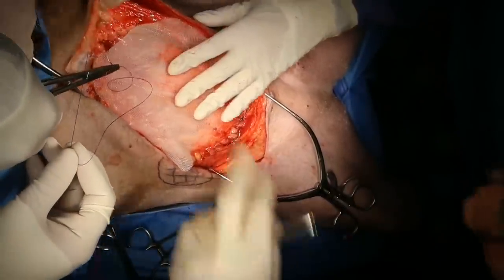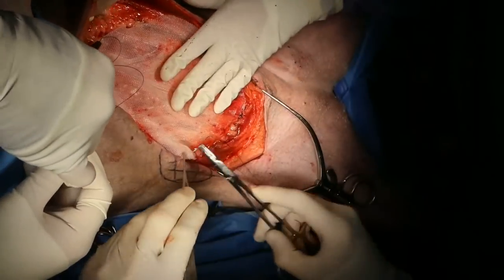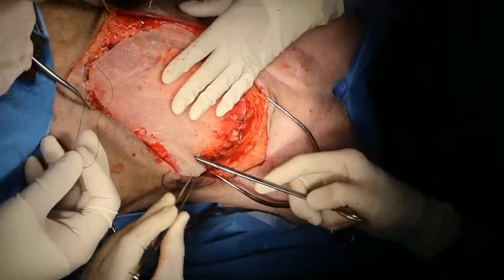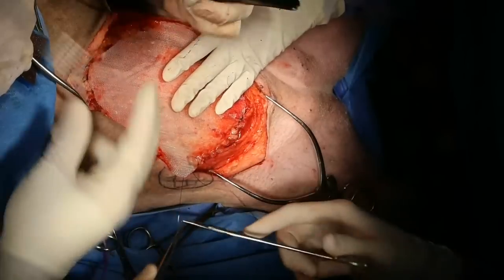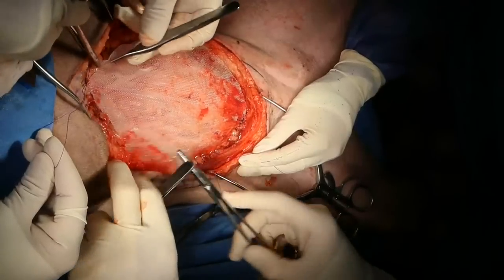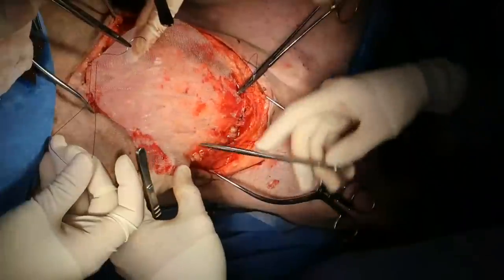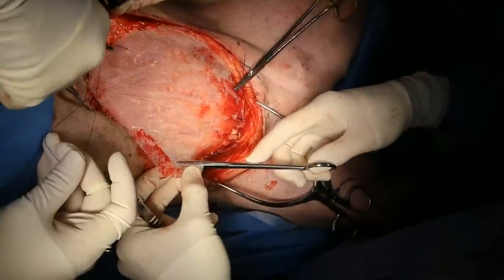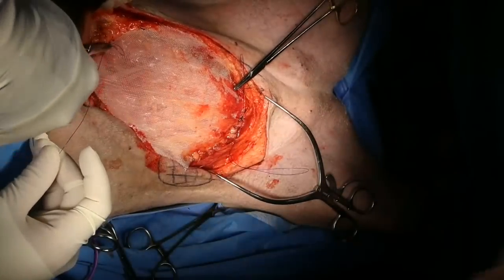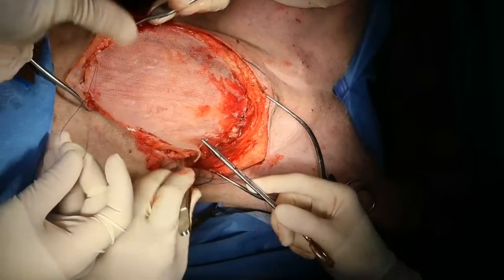Now, Charles, you're down here. Yeah. You're going to come down this body. Yep. This just body. Outside there. Yeah. And if you can get the layer that you sutured to with the peritoneum, go through that and then pick up rectus as well. I might trim a little bit of this out. You'll be fine. Since we could have almost closed it primarily. So what you mean is grab both muscle bellies over here?